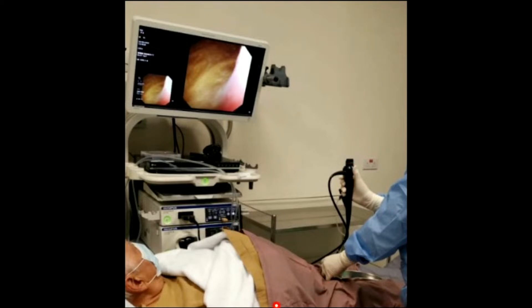This is an example of the flexible scope being used. Most of the time nowadays these are hooked up to video scopes so we can watch on a monitor. Patients can watch too — as you can see this patient is just watching his cystoscopy, which kind of takes your mind off things and is interesting to watch. Most urologists prefer the video scope view rather than having their face right up against the scope, though sometimes we still use the old scope system depending on what we need to do.